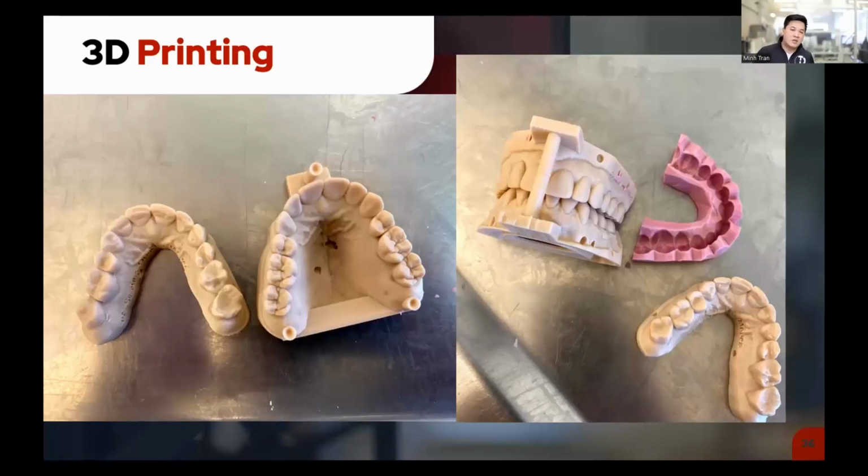And there's pros and cons to both. So if you're using a light cure only type of composite or something like that, then you're kind of relegated to using a clear suck down thermoform. They do have clear silicones as well, but they're not quite fully transparent. They're a little bit translucent, but you'll get a little bit of light in there.